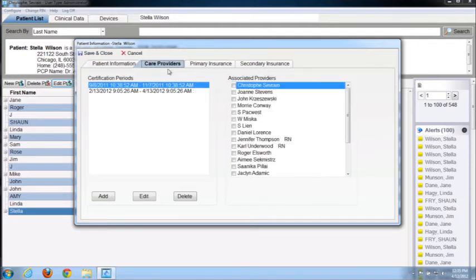The Care Providers tab is an important set of information. This is where users of the systems entered earlier in the Configure menu are assigned the patients they are allowed to access. By selecting the box on the right-hand side, the user can view that particular patient's data. There are no limits to how many users can access a particular patient's data. For example, a physician, a nurse, a specialist, and a family member could have simultaneous access to the patient. Clinicians' certifications can be entered if required.